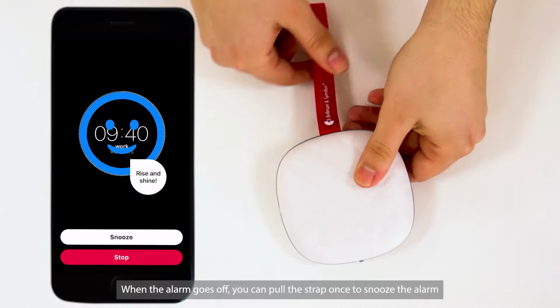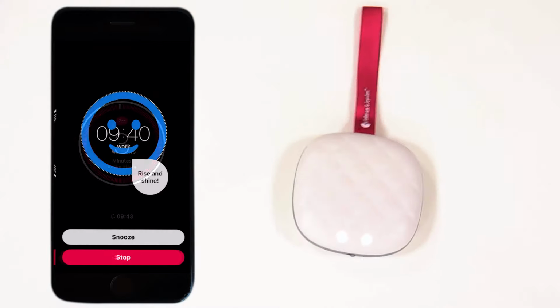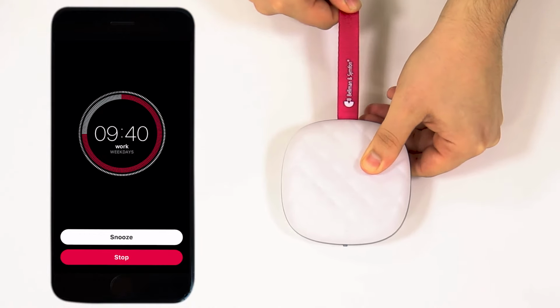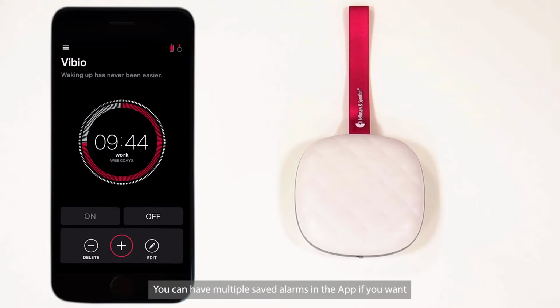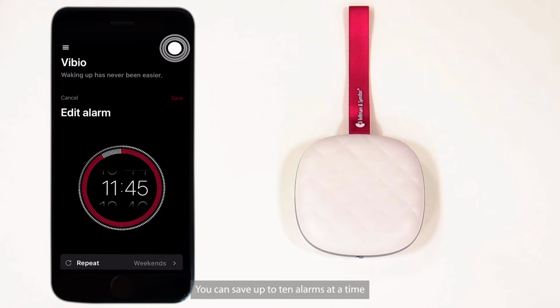When the alarm goes off, you can pull the strap once to snooze the alarm, or pull it twice to stop the alarm. This can also be done from the app. You can have multiple saved alarms in the app if you want. Just press the plus button again and set a new alarm. You can save up to 10 alarms at a time.